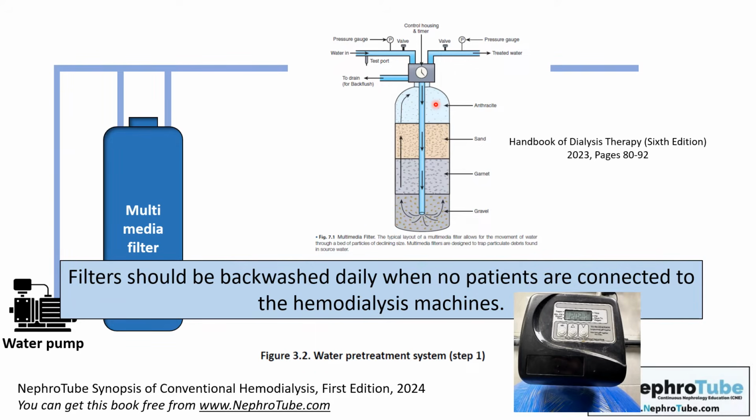The water will start to move from the first upward layer going down, and it will push the debris with it to go out from the filter of the tank. So the filter will be not obstructed now, because we get rid out of the particles, including the particles of this filter.